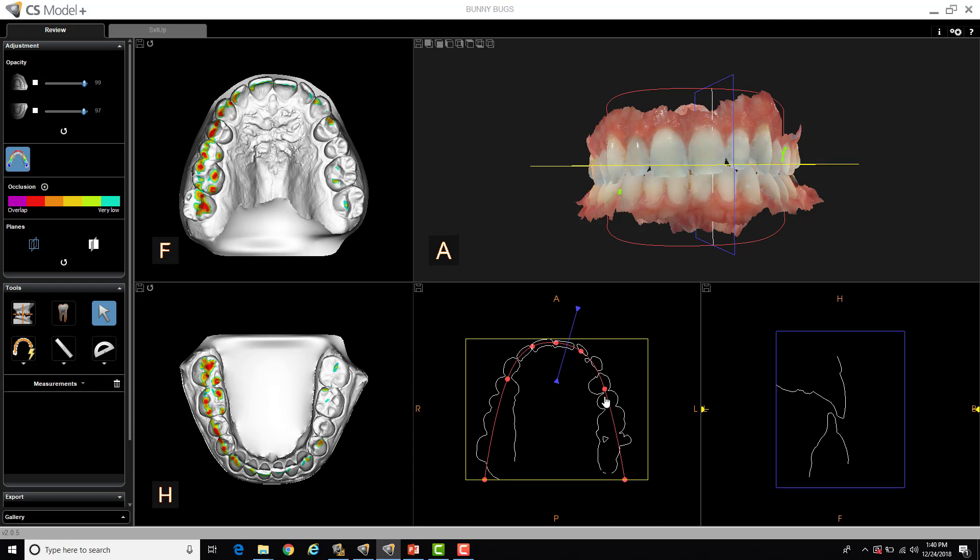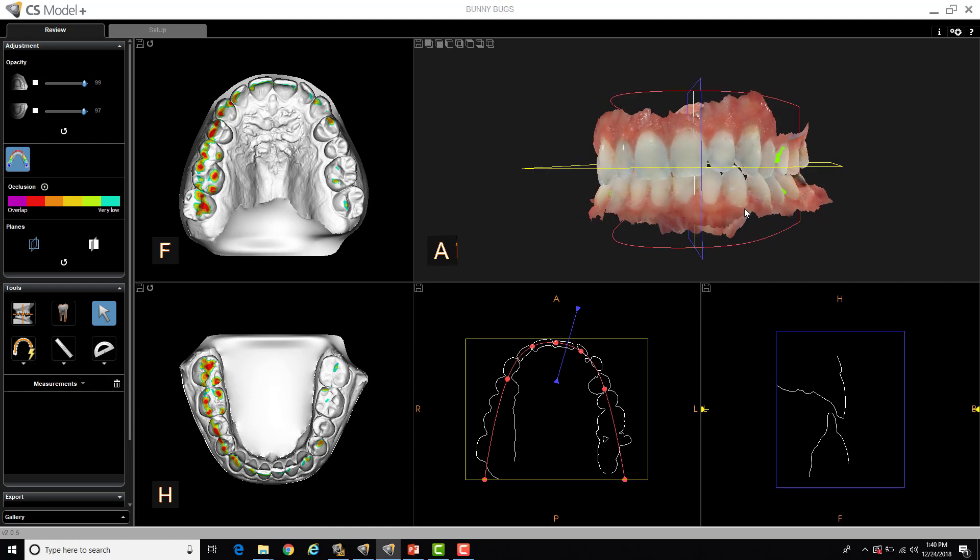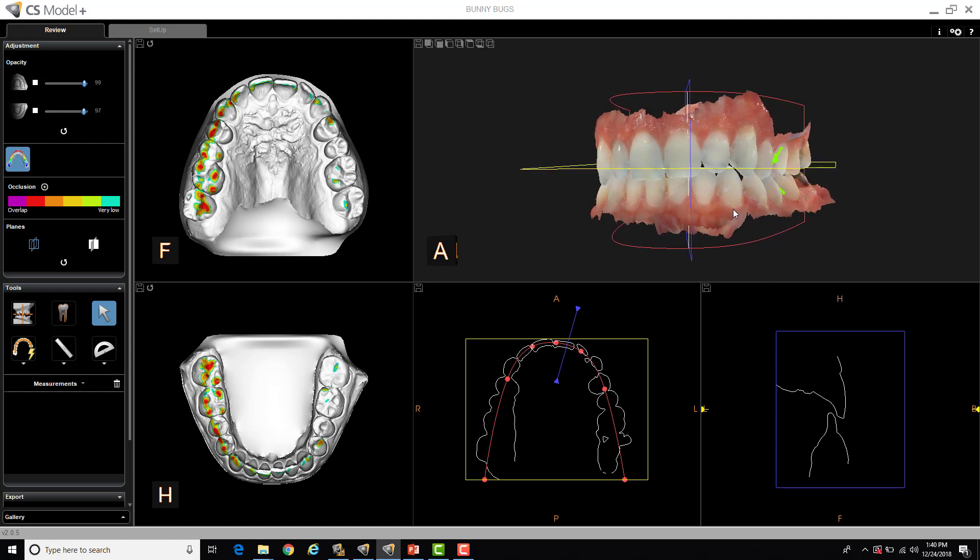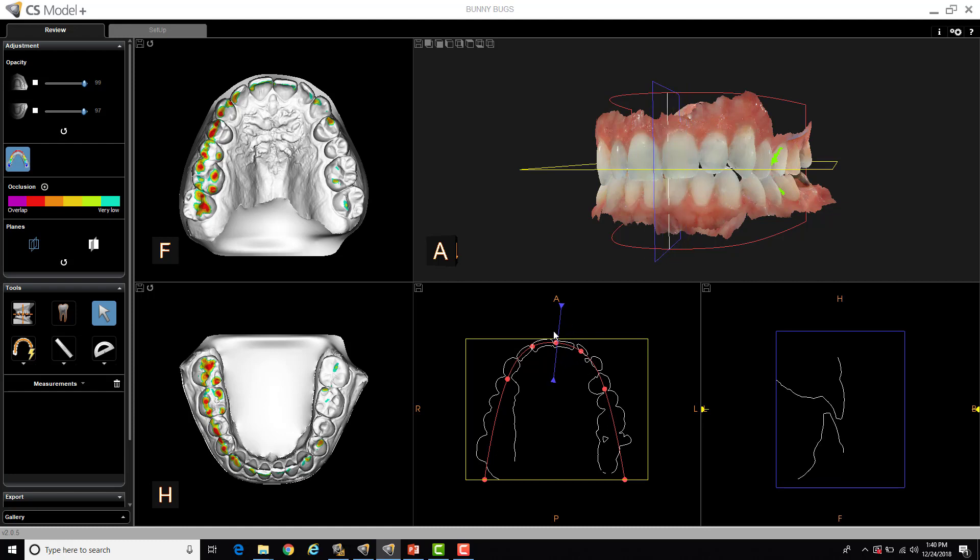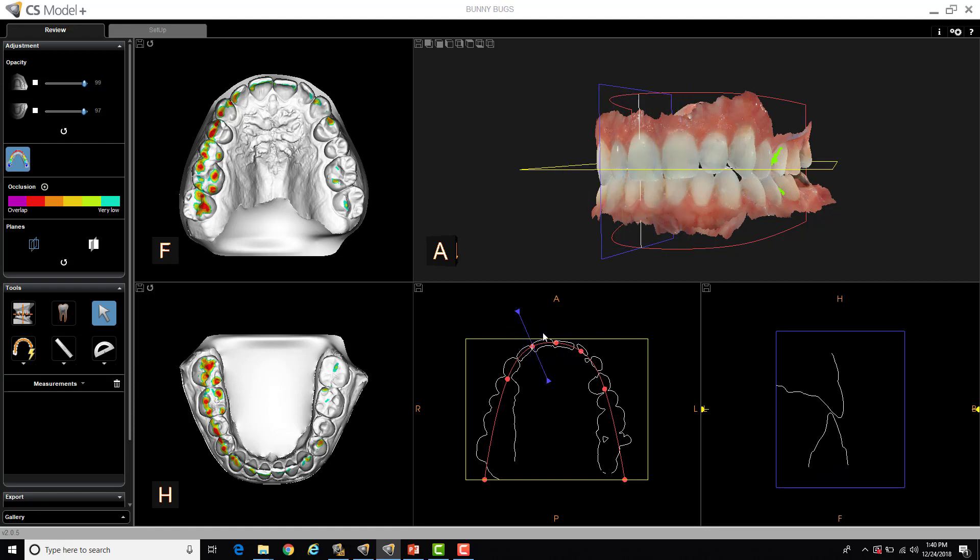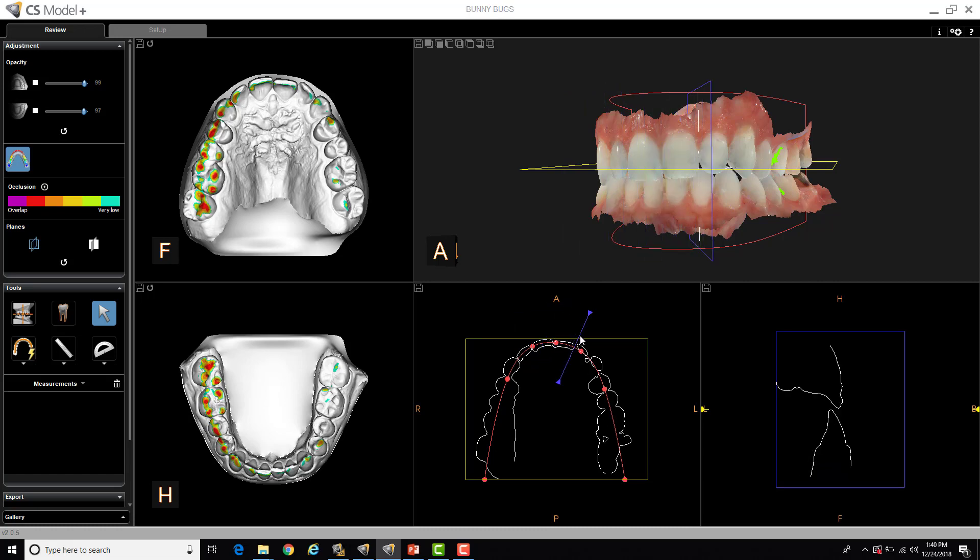In addition to that, my blue cut plane, similar to CBCT. This is similar to your transaxial slice on a CBCT, but it's just displaying the patient's occlusion in blue. This is the blue pane that I'm seeing right here. And then this blue cross-sectional view is that same exact view. I can put my mouse over it where it turns into a finger, left-click and hold it, and then just move it around the arch. And you can see in the lower right how the patient's occlusion changes.